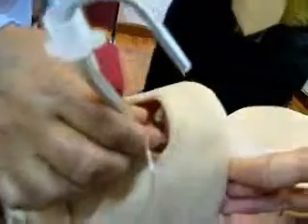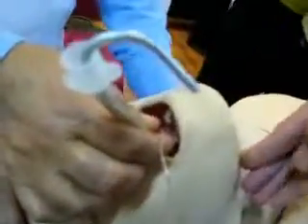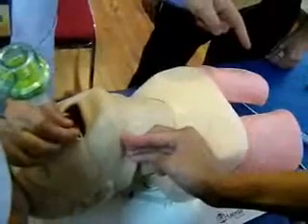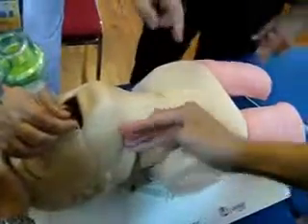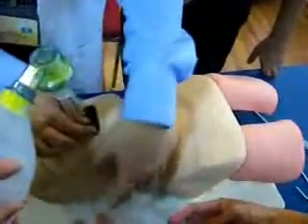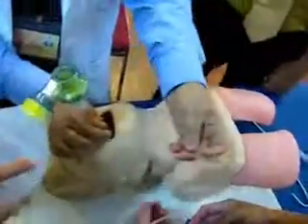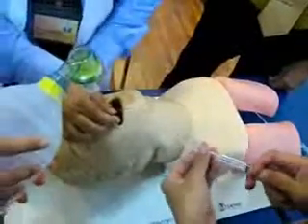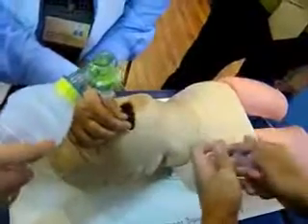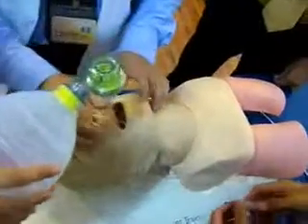Make sure the endotracheal tube is inside the trachea. Take out the bougie, put the ambu bag on, and see that the lungs get inflated — observe the rise and fall of the chest. You can inflate 10 ml of air to inflate the balloon of the endotracheal tube.